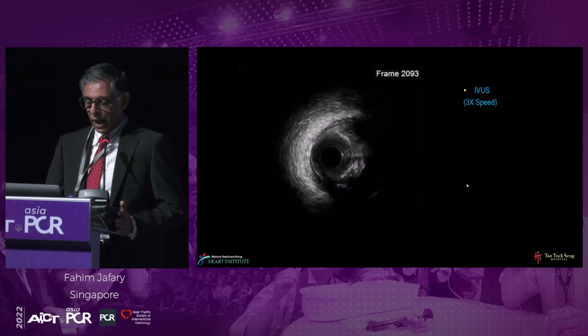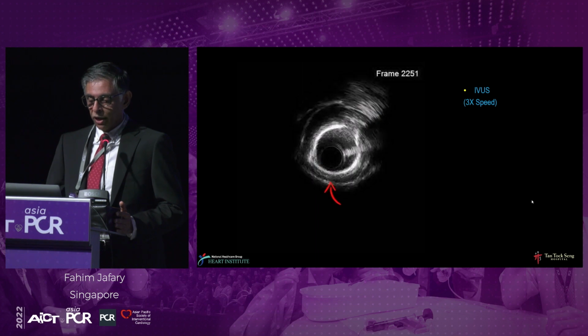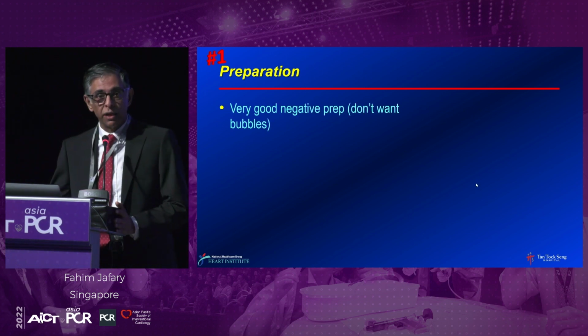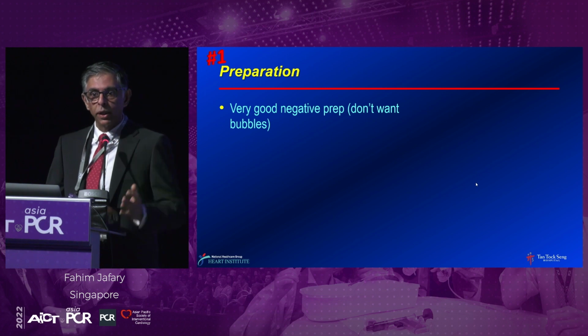And I'll just let this play out for just a brief second. Again, ring of calcium over here. Stuff that you don't want to see. So this brings us to the first principle of IVL, which is that, for preparation, you need a very good negative prep. You don't want bubbles in the IVL because bubbles don't conduct electricity.